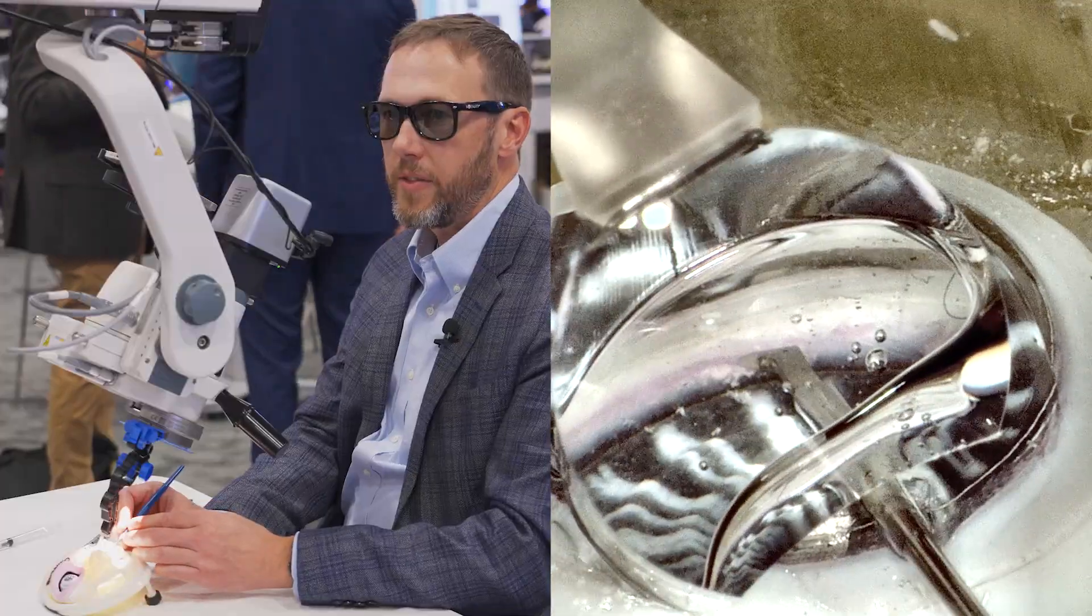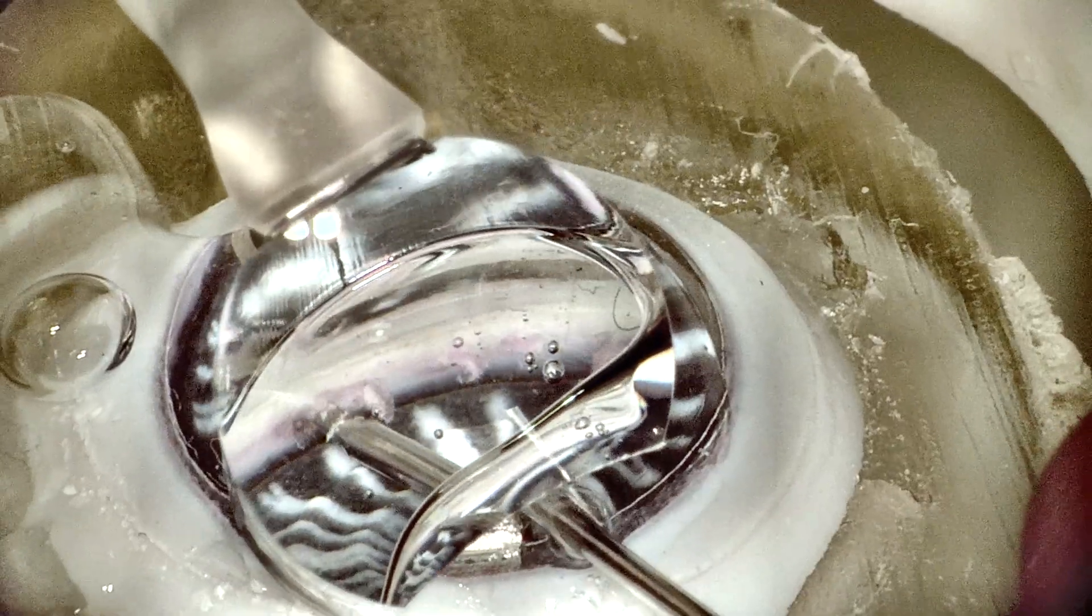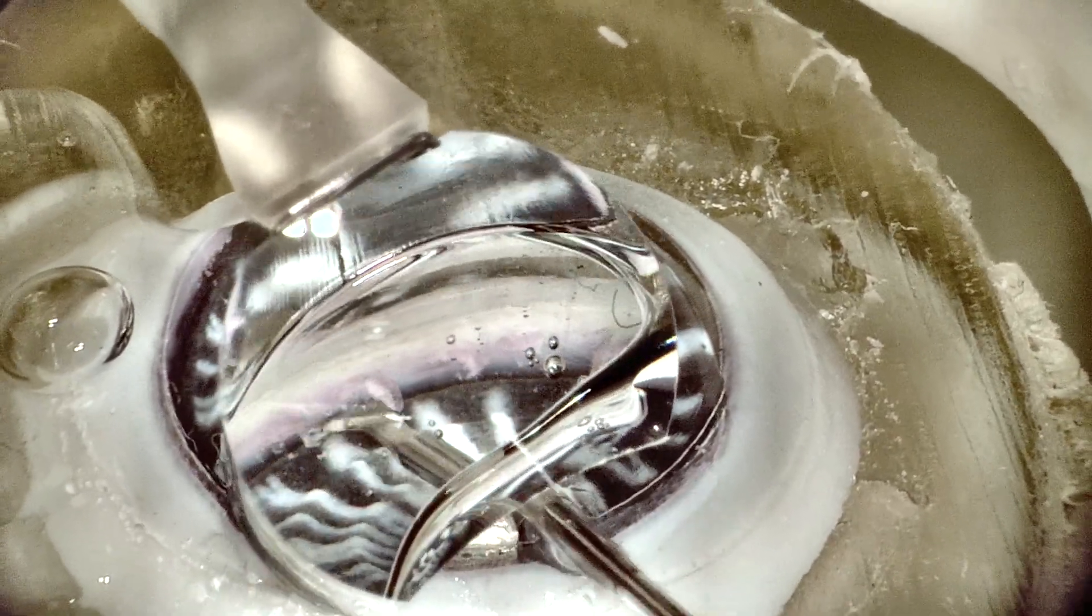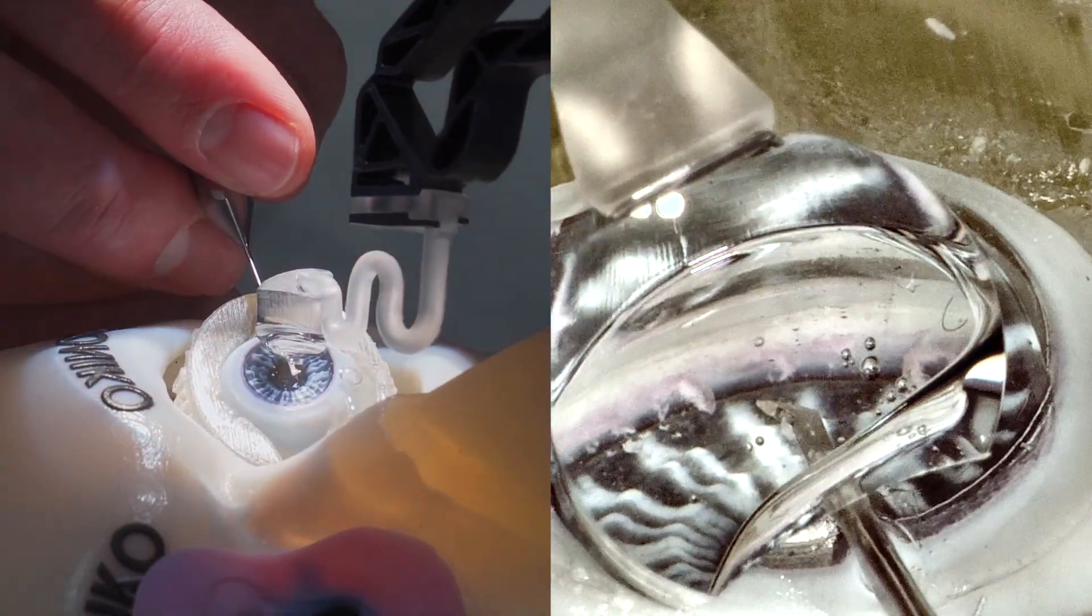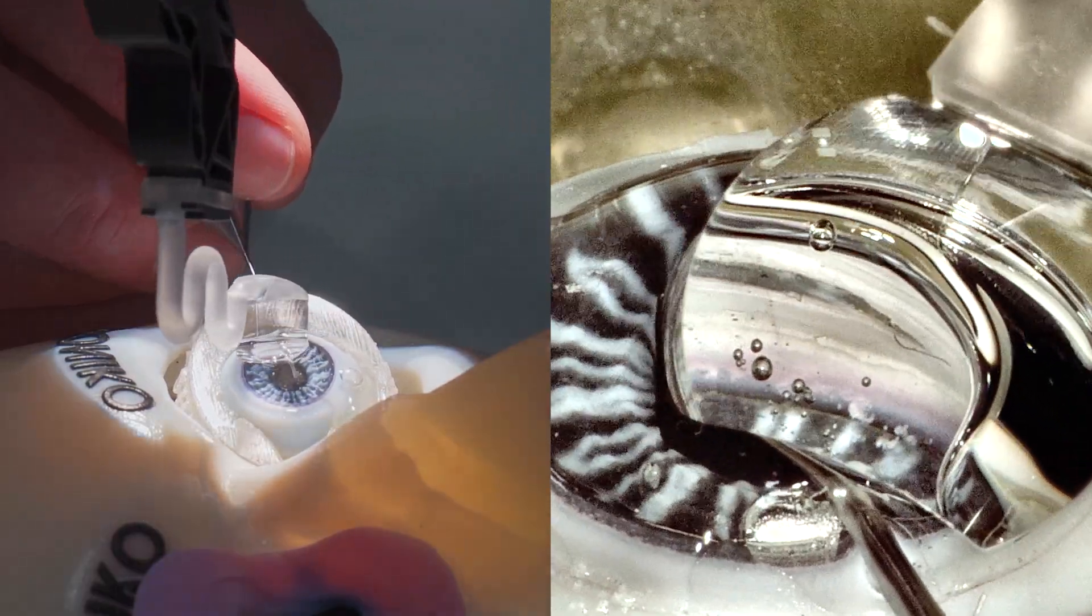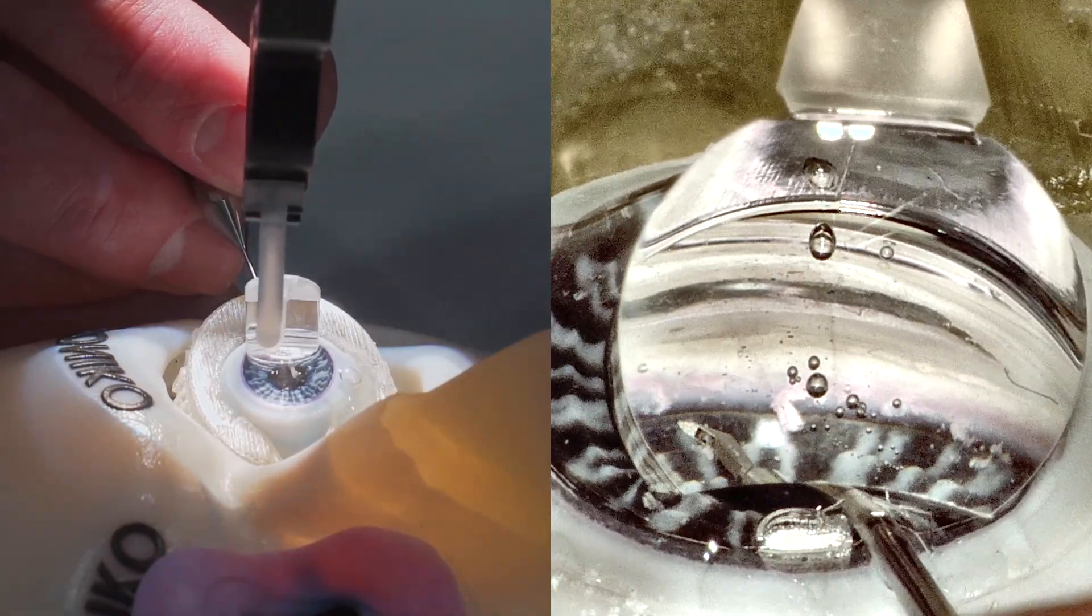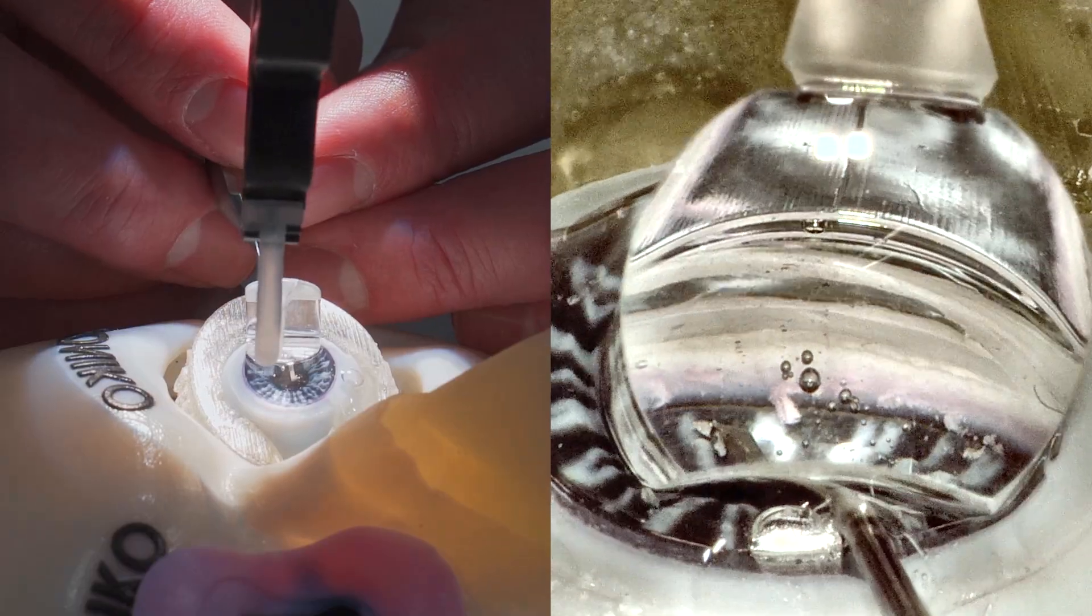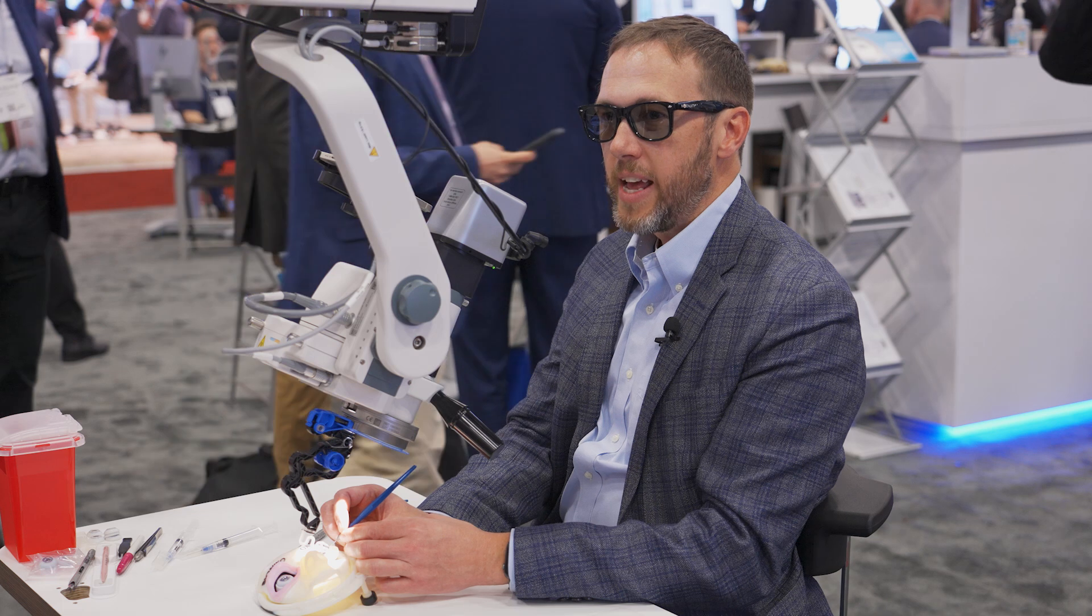I'm going to continue extending this goniotomy incision. You also see the cutout of the lens here around the wound of the device, which is a really nice feature to prevent your instrument from displacing the lens. If we want to go all the way to the right, you can see how we can do that by swinging it in this direction. You still have that same wide field of view, you still have that freedom, but now I've got both hands on the device that I'm using at all times.